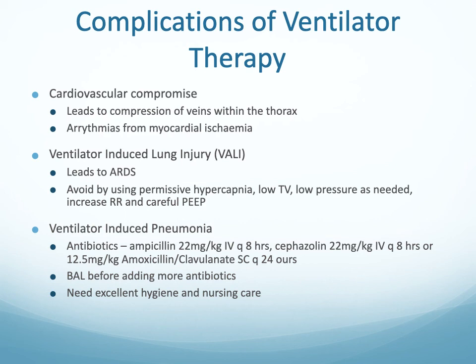You also need to make sure that you're using excellent hygiene and nursing care, so use gloves where possible, keep the oral area moist and clean with antiseptic, and use sterile ET tubes and sterile suction tubes when suctioning the endotracheal tube.